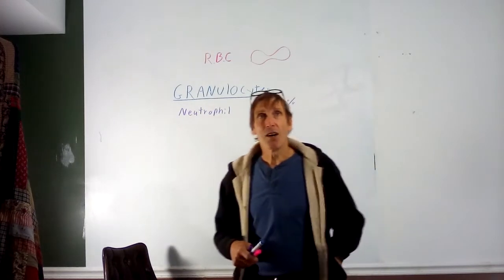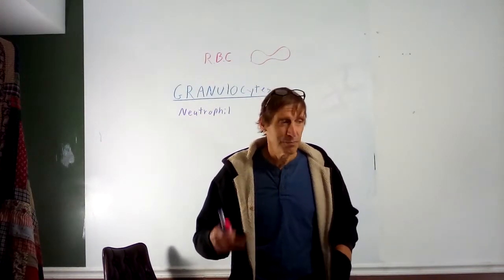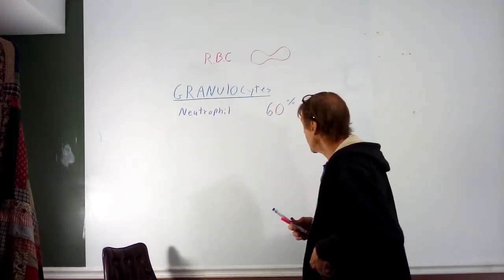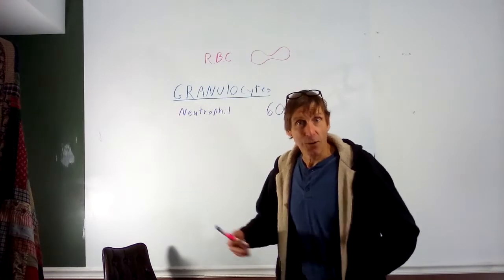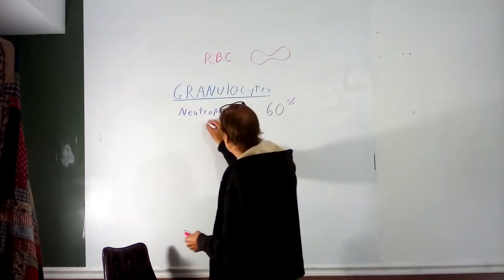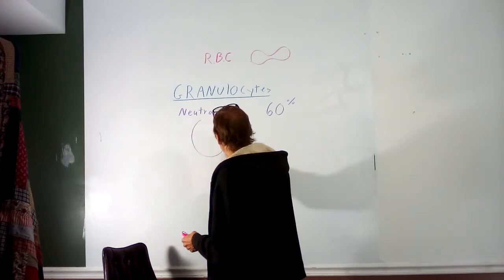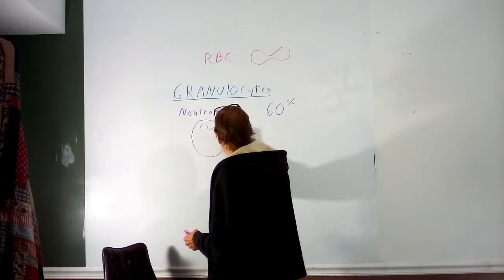And neutrophils are phagocytic. They'll engulf cell fragments, viral particles, bacteria, that sort of thing. And they tend to increase in number when you have an acute infection, early onset of an infection, bacterial or viral. The way you'll identify them, the nucleus of a neutrophil is multi-lobed.